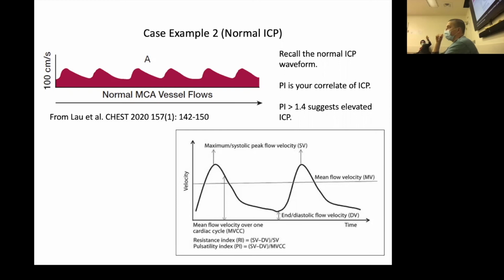Right. So what's the sign you pick up early that you lose your control? So if you look at the waveforms, so normal MCA waveform, let's just assume ICP is 15. As the pulsatility index rises, you know that it's becoming greater than 15, and it's lower than 60. So it's not so much the PI that I'm looking at, it's that is my waveform changing such that it's moving towards that 60. So it's a vector as opposed to an absolute number, if that makes sense.